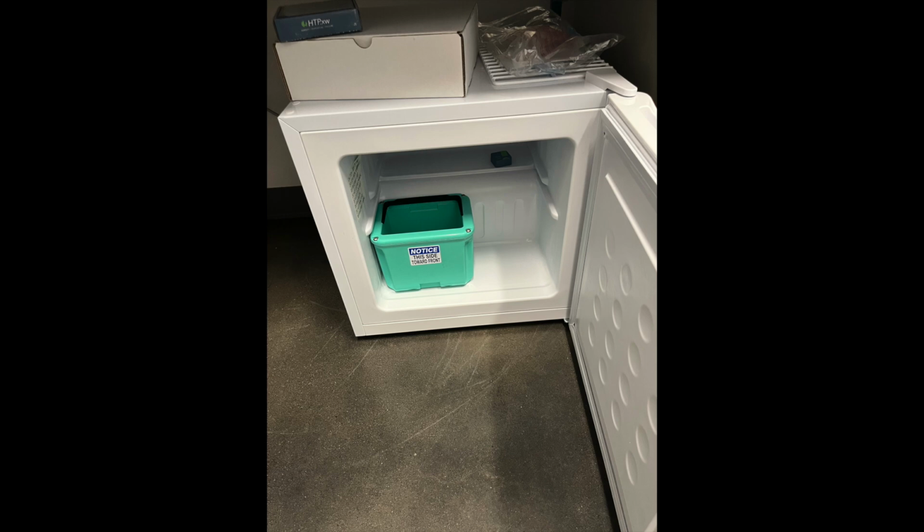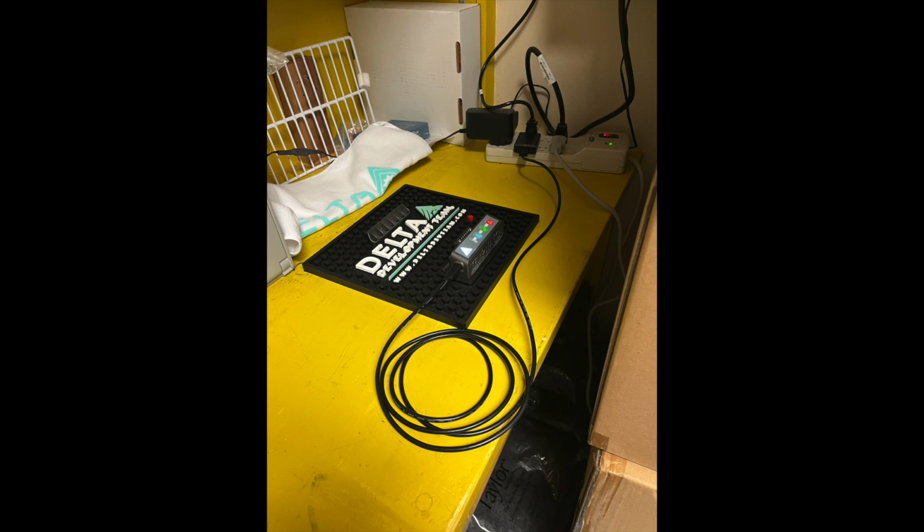You open up the freezer and grab the green insert and you're going to drop it onto this temp mat. Now these temp mats are kind of finicky. You actually have to set them on there. Initially the triangle will beep at you and it'll be red. Just give it a little firm downward pressure and it'll engage on the pins. And then you're going to start to look for one of three readings on the temp mat.